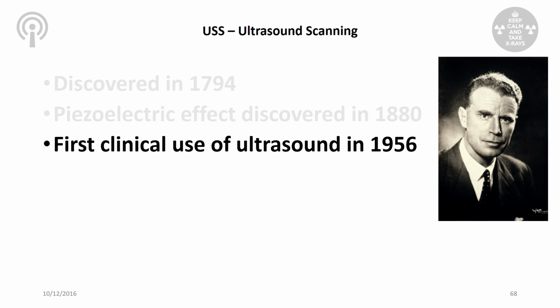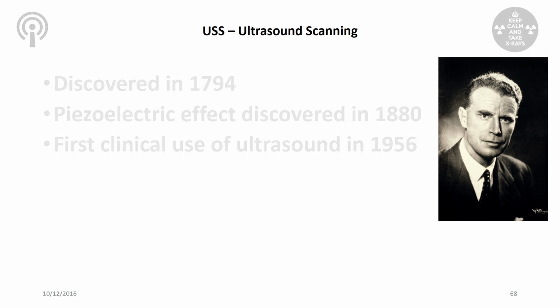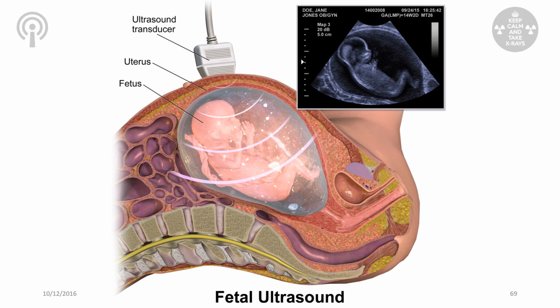He had an idea when he saw people working at the Glasgow docks and shipyards. They used ultrasound to look at the metalwork on various parts of ships, or metallurgy. And he thought, could this be applied to looking non-destructively at fetuses? And it transpired from there. So fetal ultrasound is probably the one that everyone recognizes. Now, this diagram shows you pretty much how it works.